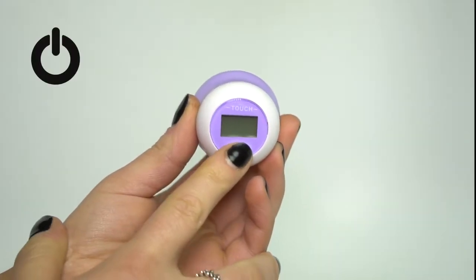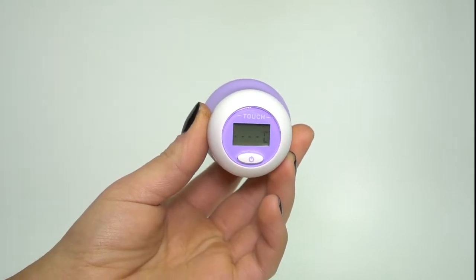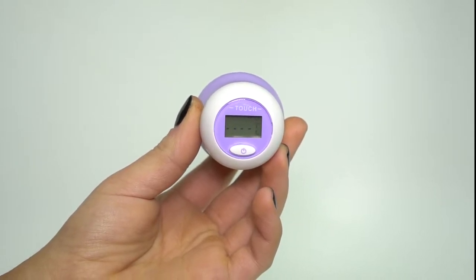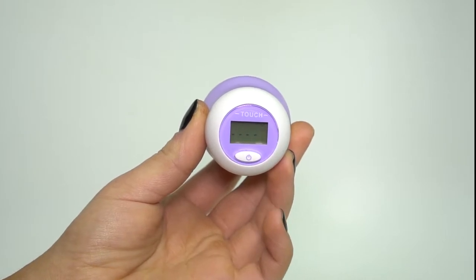Turn the thermometer on by pressing the on/off switch. The LCD screen will illuminate with the blue backlight. A beep will be heard and the backlight will turn off. The screen will then flash with the degrees Celsius. The unit is now ready for use.